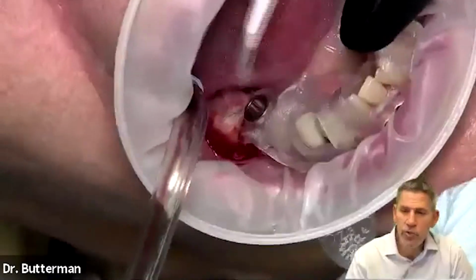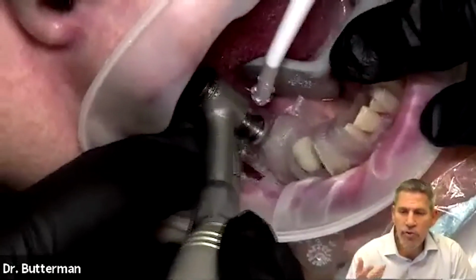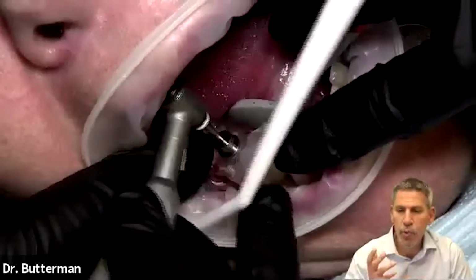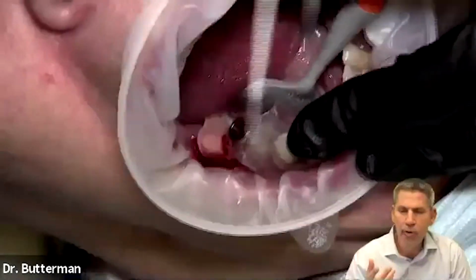This is the initial drill. It's going to remove a little bit of the cortical bone, and it's going to remove any remaining tissue around that punch and just get the site ready for the osteotomy. Now we're going to do drill number 1. And you'll be able to see as these drills come in, there is a sleeve attached to it, and that's what's shrinking the diameter of that hole.